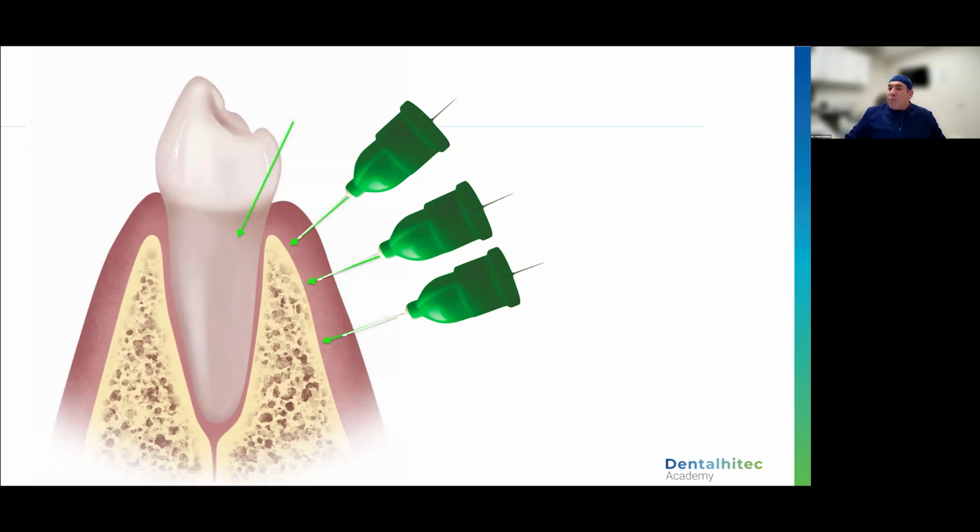the papilla. What I encourage everyone to do, and this may sound funny for those of you who've been in practice for a while, is that the next time you extract a primary tooth, look in the socket. And not just look to see if you have root left or soft tissue, or if there's infection. Actually take out the tooth, rinse it off with sterile saline, and look at the cortical plate. Look to see where you would be entering with that needle. Look to see the angulation of bone. I promise you, if you do that in several areas in the posterior and the anterior, you're going to have a much better idea of the angulation you're going to place these needles.